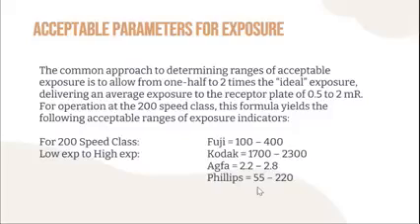It's because, as I have said, at 60% you already get quantum mottle, so what more for the half, such as the lower margin of your exposure scale. So that means you have to, as much as possible, avoid the lower margin values for exposure indicators because it will yield quantum mottle.